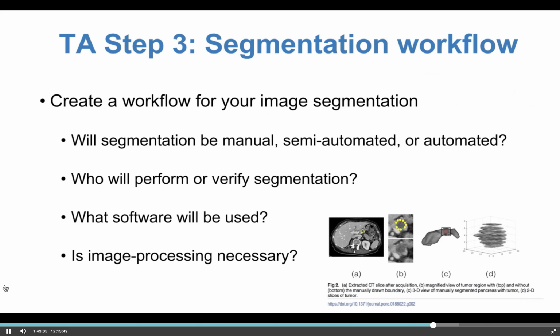You can use something that's commercial, for example, TeraRecon, or something that's open source like ITK-SNAP. And be aware that some software will require some kind of image preprocessing, so you can't directly use the DICOM images for your segmentation, and that may affect your texture analysis as well.